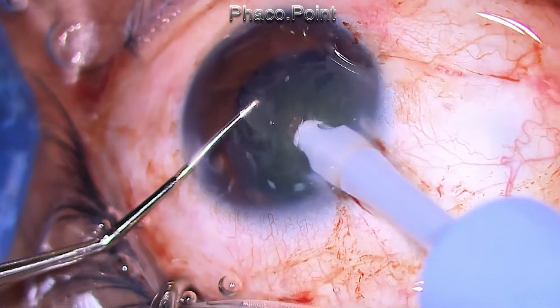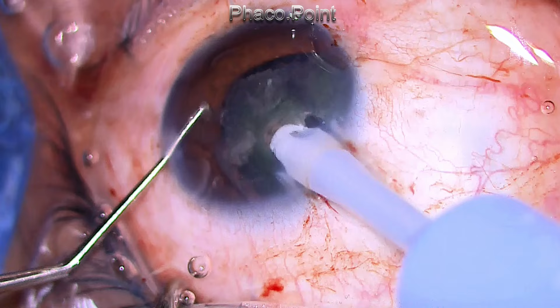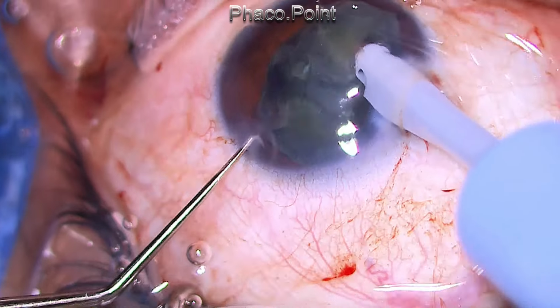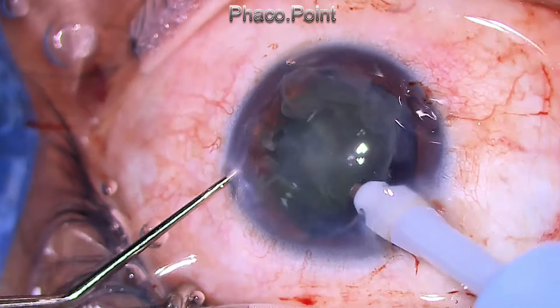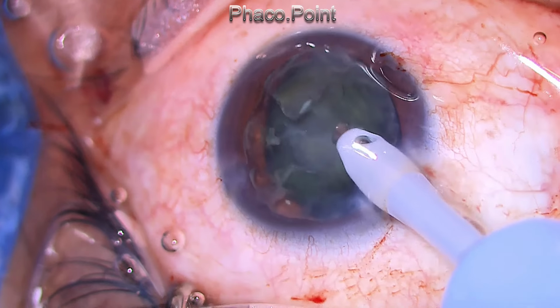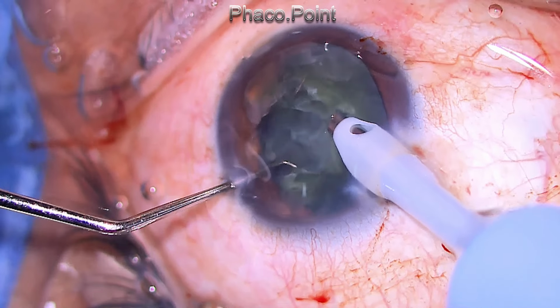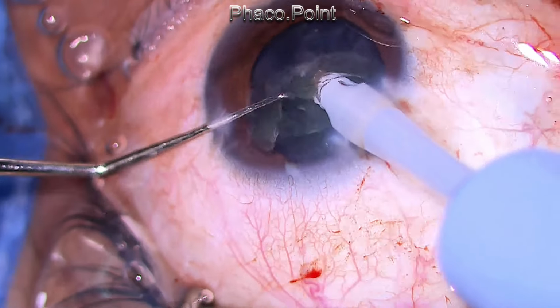Two important lessons I learned in this case. Firstly, implant the capsule tension ring as early as possible. Use a manual method. Get the right plane of the leading eyelet of the CTR into the capsular bag, and then gently support the capsular tension ring at the point where it enters the anterior capsule, and then you can put it in place. And once you have a CTR in place, everything goes well.